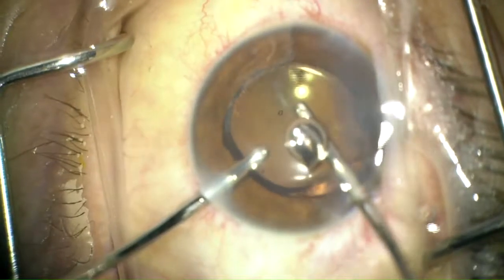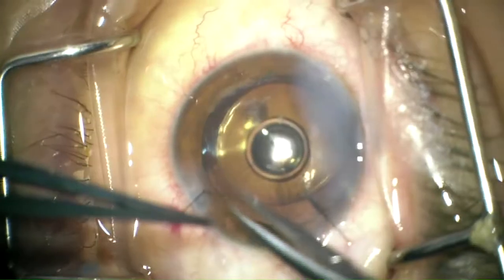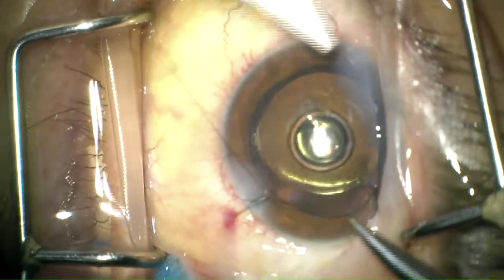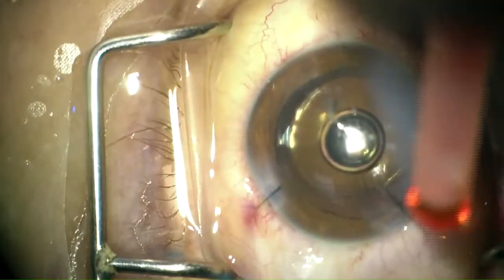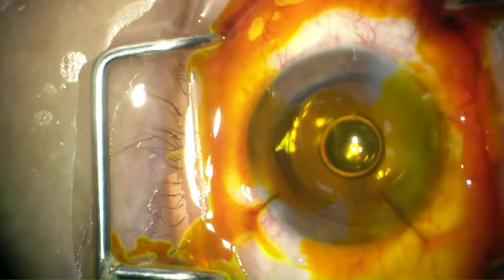A 10-0 nylon suture was then placed at the main wound, followed by removal of viscoelastic substance. Another suture was placed at the paracentesis, and with the use of fluorescein, the wounds were checked for integrity. The self-sealing corneal laceration held tightly throughout the procedure.